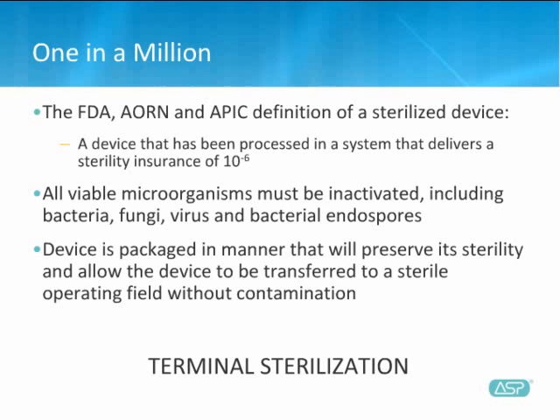Terminal sterilization is the best practice for devices intended for use in the operating room setting where the device may touch normally sterile tissue. High-level disinfection is a process where all viable microorganisms are inactivated except bacterial endospores. High-level disinfected devices are generally not packaged in a manner intended to preserve sterility and have residual moisture from the rinsing portion of the process.